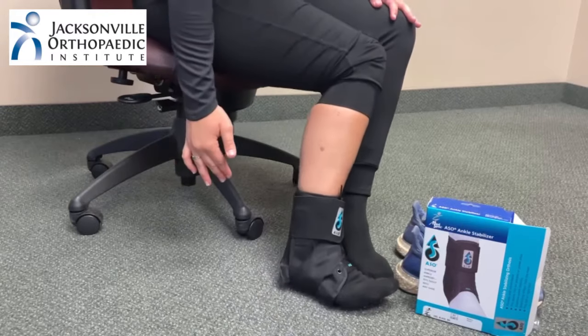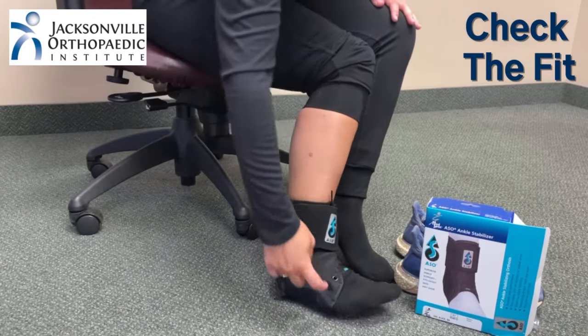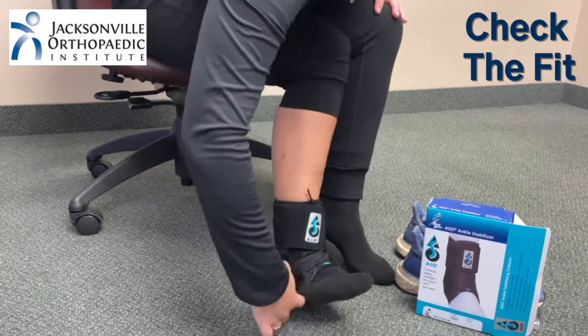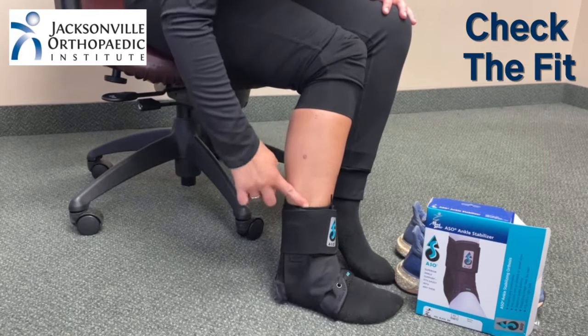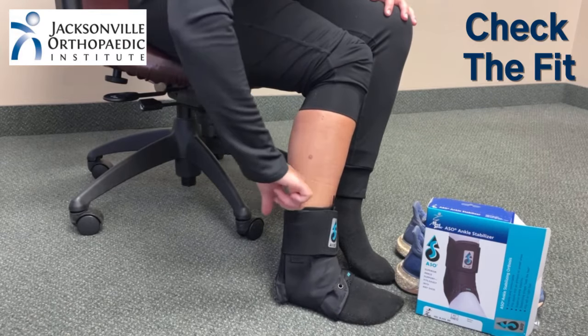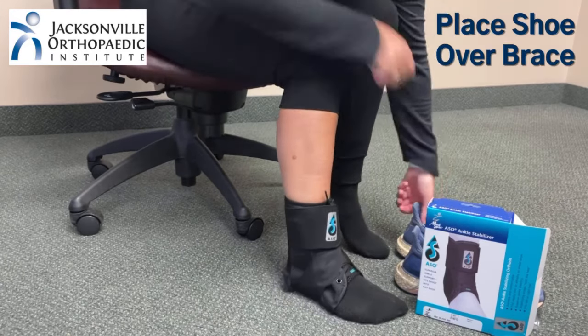Now that the brace is on, make sure it's not too tight. Slip one finger in at the bottom and confirm you can fit a finger around it. Do the same at the top of the brace. Once it feels right, you can put your shoe on over the brace.